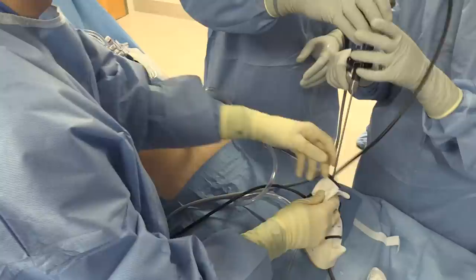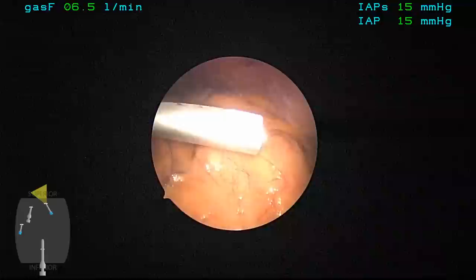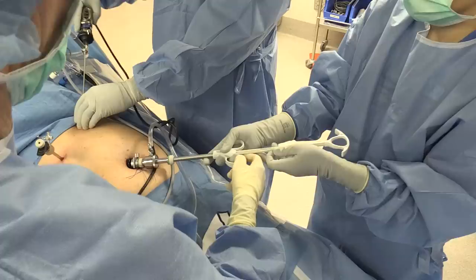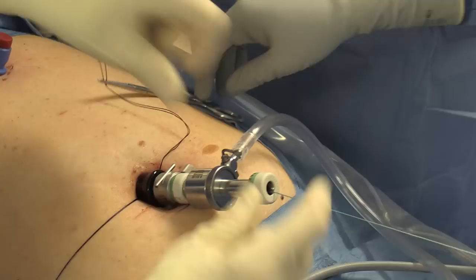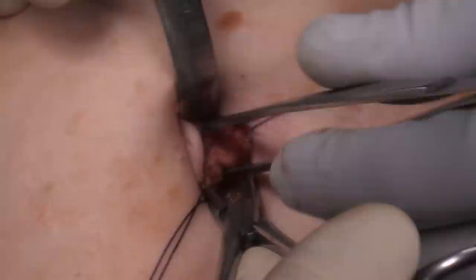This requires moving our laparoscope to the epigastric port site so that the bag can be inserted through the larger umbilical port. The bag is deployed, and the gallbladder is then brought over and put into the bag, which is then closed and removed at the umbilical port site. This shows the intraoperative view of that. The sutures in the fascia are taken off of the Hassan cannula, the CO2 is turned off, the cannula is removed, and then the gallbladder and bag are taken out.